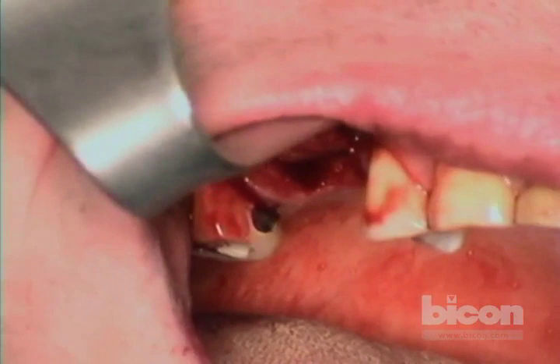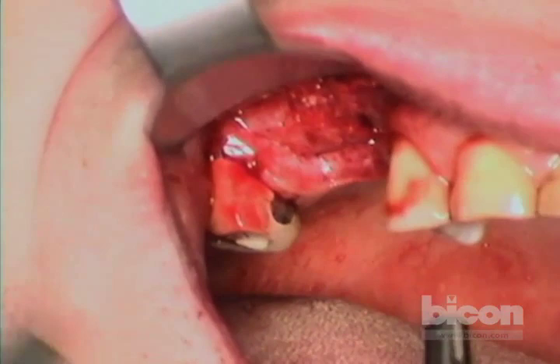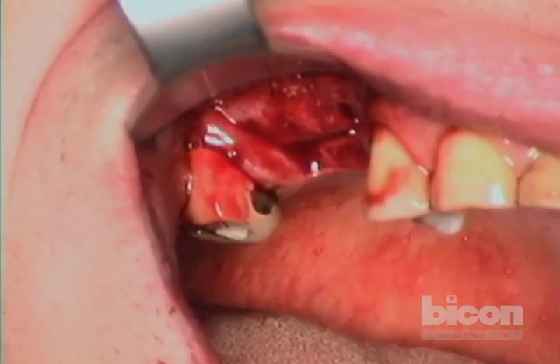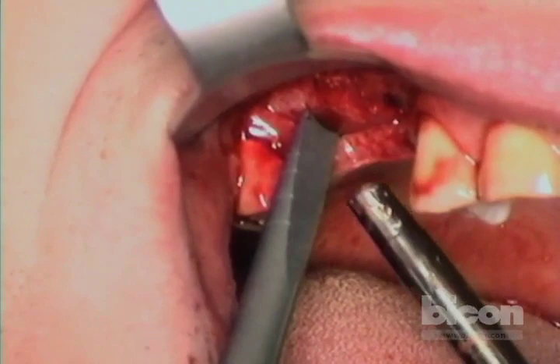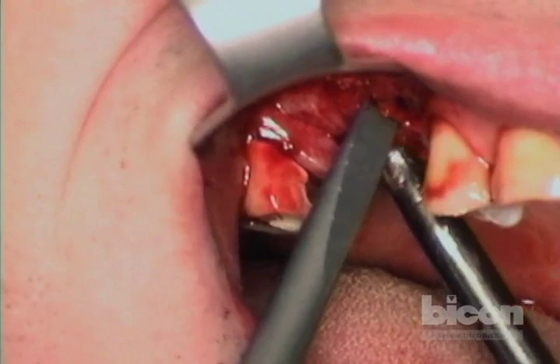The important aspects are to leave enough room away from the implant, away from the tooth, and away from the flap — it's a bit of a juggling act. I'm going to leave myself about two millimeters from the edge of the flap. With a little tapping, you're really not doing a lot of cutting — you're more scoring that bone. Now I'll do the narrower sides and try to get as big a rectangle as possible.